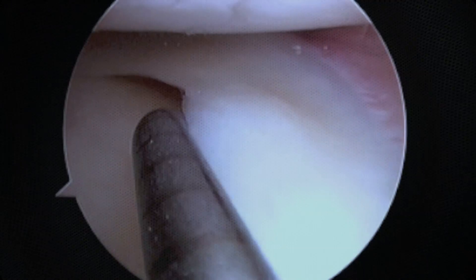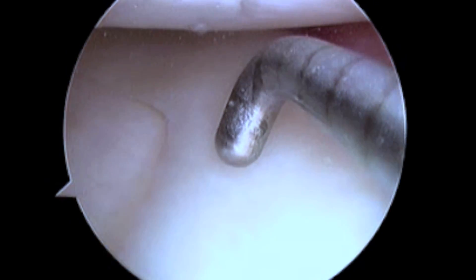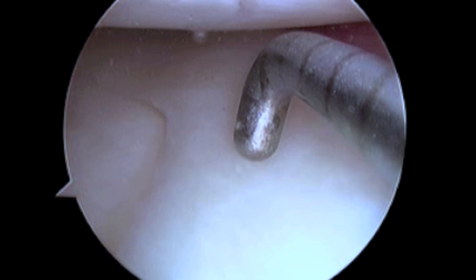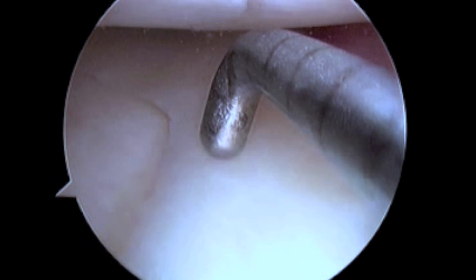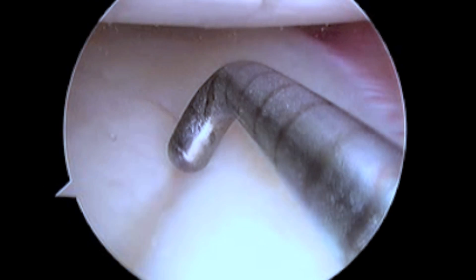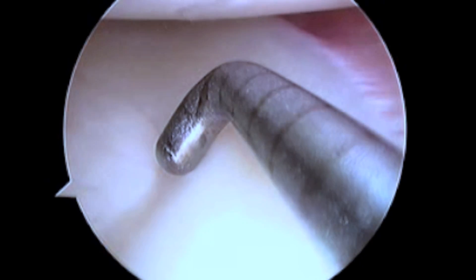The success of meniscal repair surgery is based on several factors including the location, pattern, and length of the tear as well as its chronicity. The most important prognostic criteria for successful healing after meniscal repair is the vascularity of the meniscal fragments.